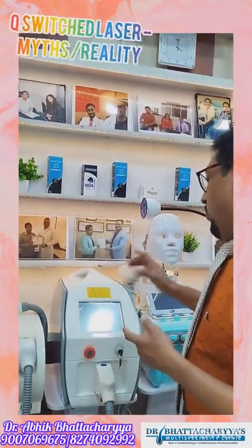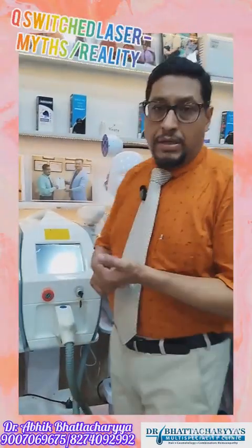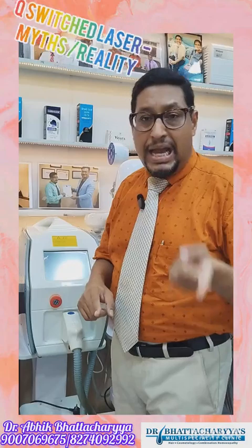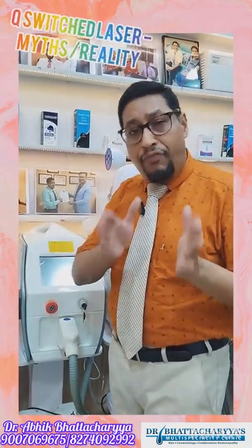Okay. Now let us discuss what this machine actually does. Do you know what laser is? Laser is not a machine, it is a technology. The full form of laser is light amplification by stimulated emission of radiation.